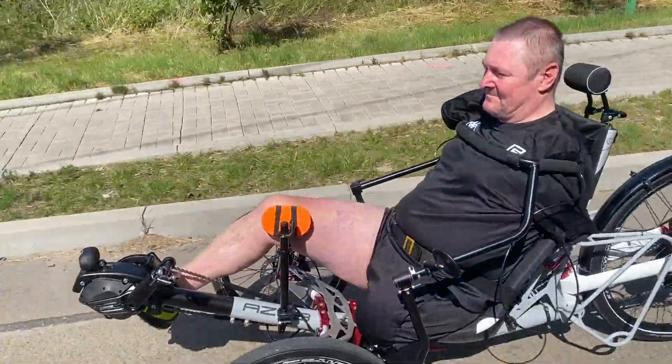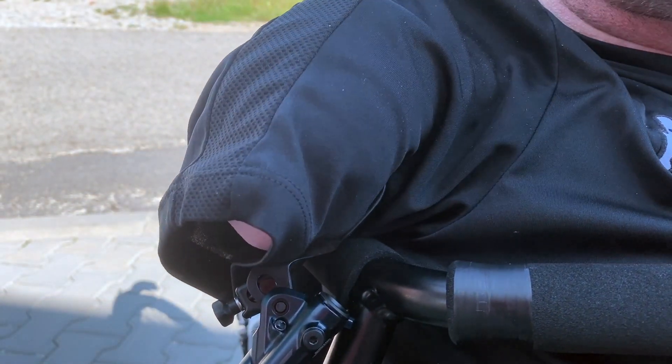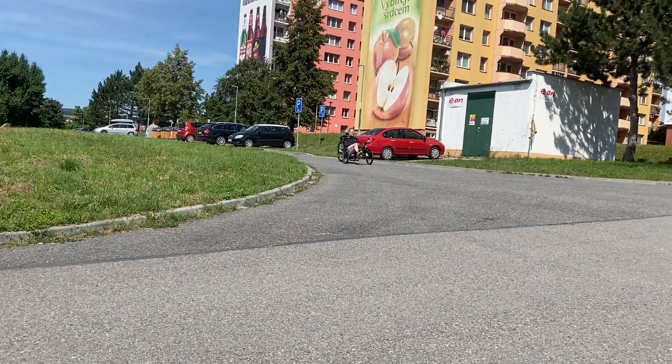The brakes are controlled by pushing the knee on a large orange plate which we printed on a 3D printer. The rider can operate the rear hydraulic brake with a short piece of his right hand.